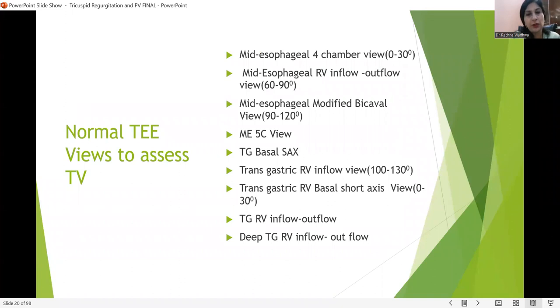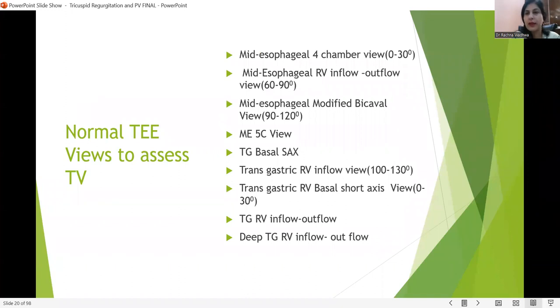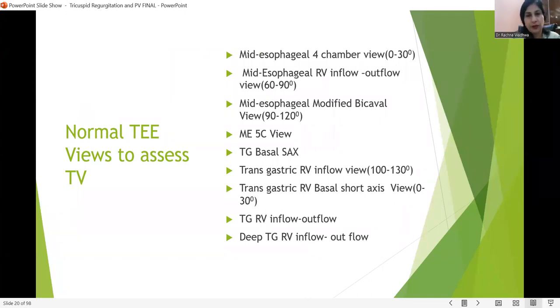The different TEE views for tricuspid assessment are: mid-esophageal four-chamber view, mid-esophageal RV inflow view, and mid-esophageal modified bicaval view — these are the primary views used always. Then there is the transgastric basal short axis view, where we can see all three cusps in one view — in all other views, only two can be seen. The transgastric RV inflow view and transgastric RV inflow outflow view give a very good depiction of the subvalvular apparatus.